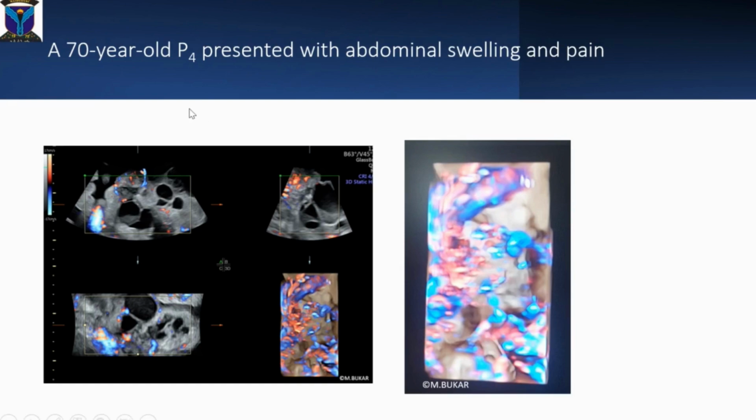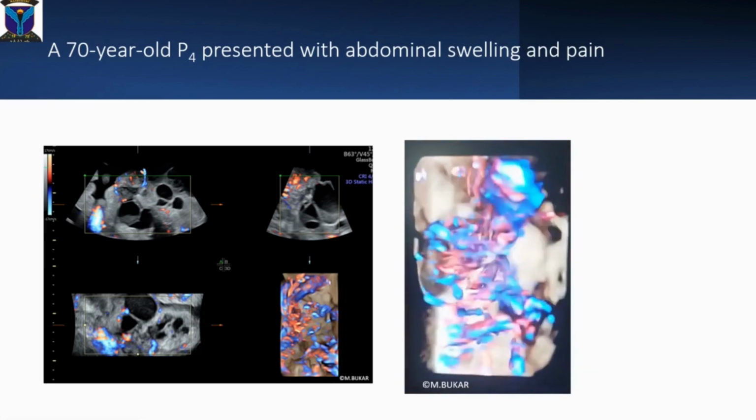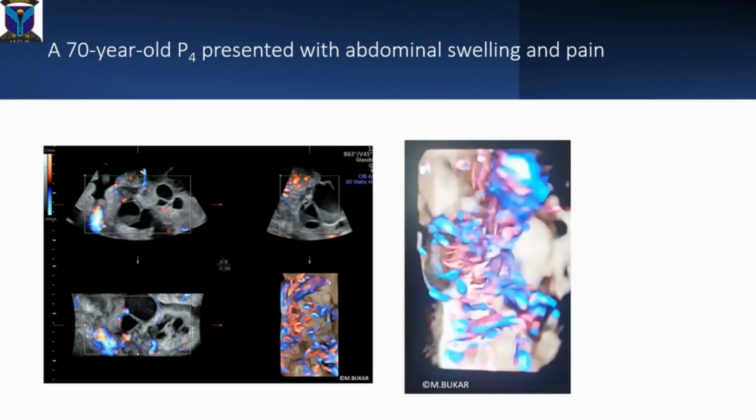Here was a case of suspected ovarian cancer. Note these features of malignant vasculature on this HD flow.